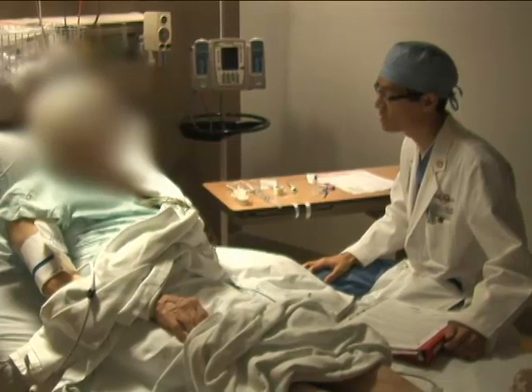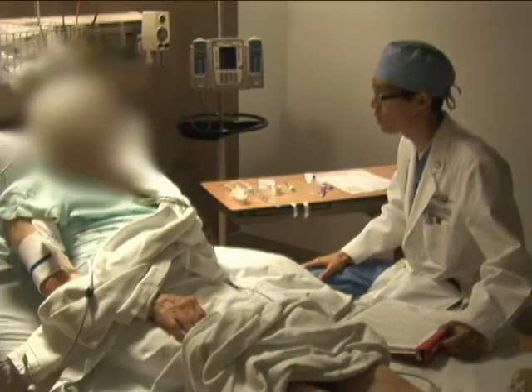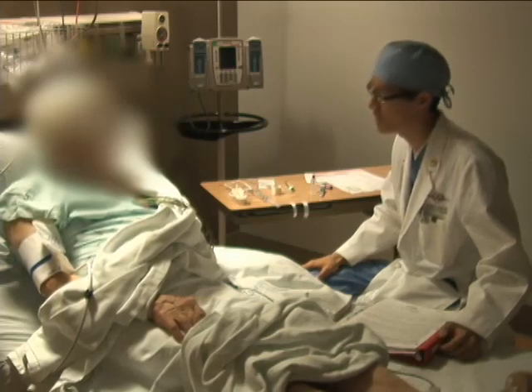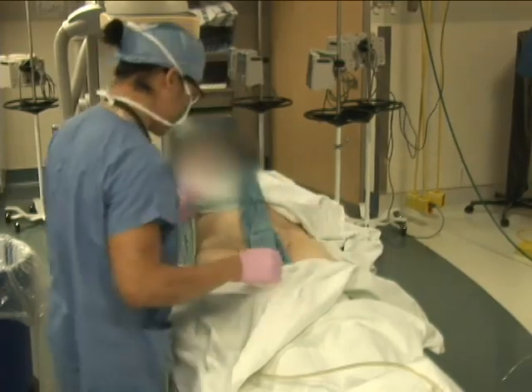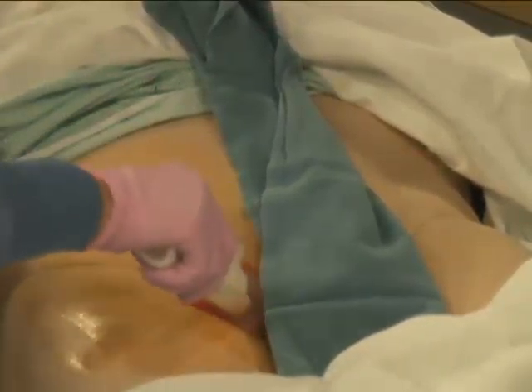Typically, a transseptal puncture is part of a more specific diagnostic or therapeutic procedure. The indications for the procedure are reviewed along with a review of the patient's medical history. Informed consent is obtained. After a focused cardiac and vascular physical examination is performed, equipment for monitoring blood pressure, oxygen saturation, and ECG is placed.